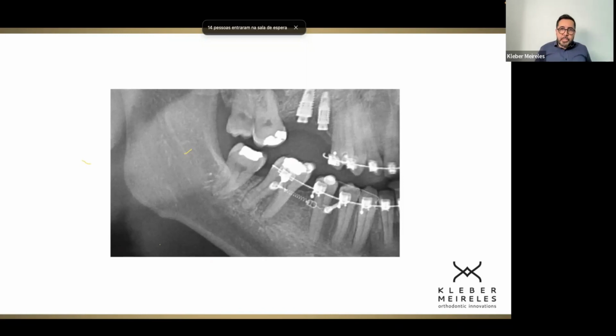And why I'm doing this, first one molar, then the other one, because I tried that several times using both molars at the same time, but it won't work properly. In most of the cases, it won't work properly. It will be very difficult for you to do that.